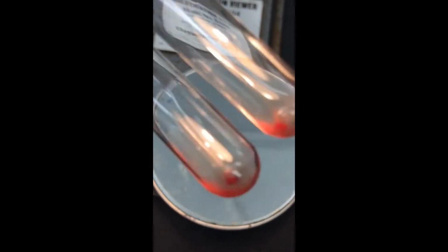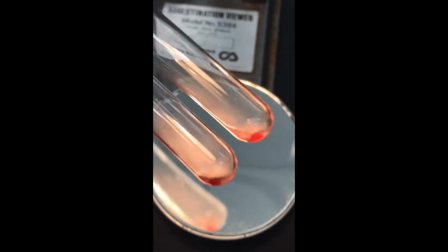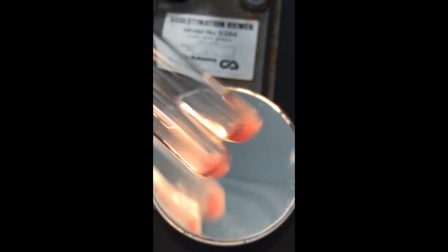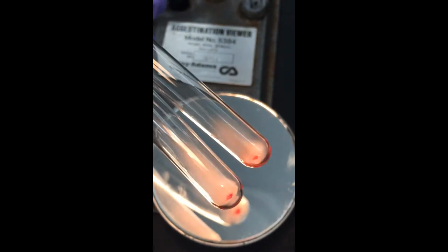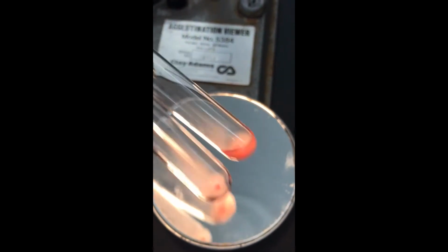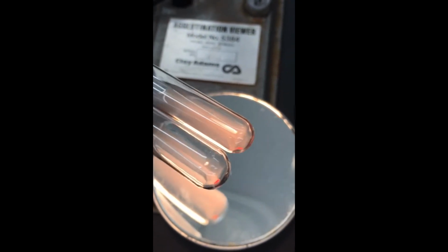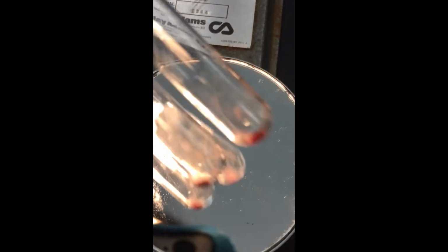Tube 11 and tube 12 from sample C, 37 degrees. Tube 13 and 14.